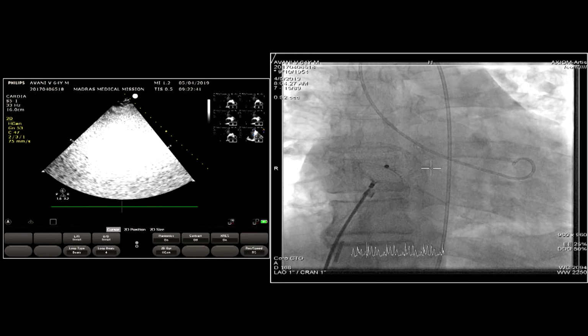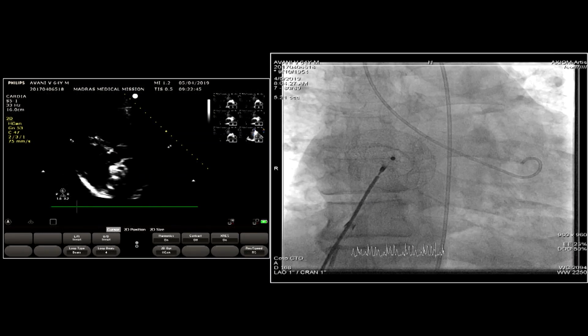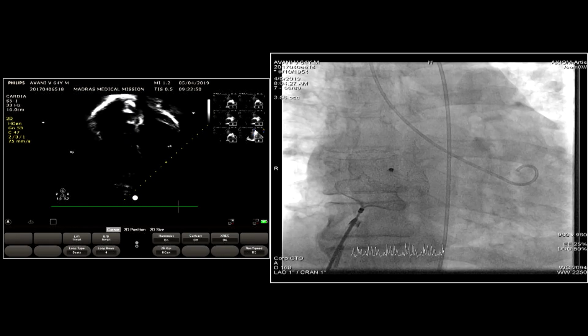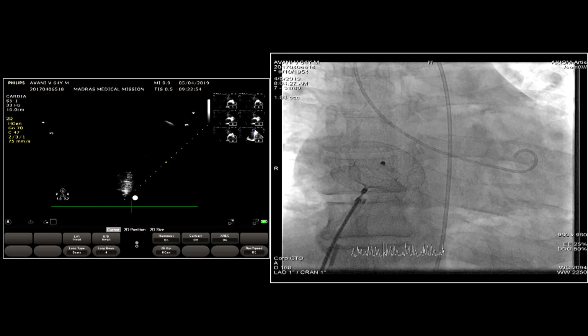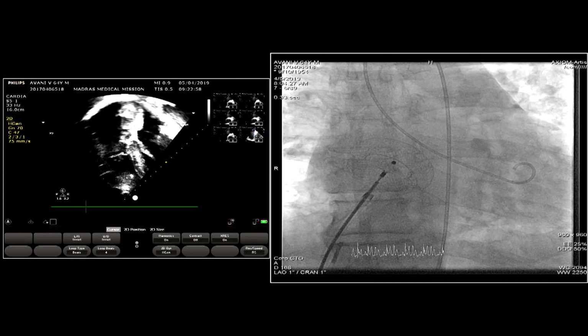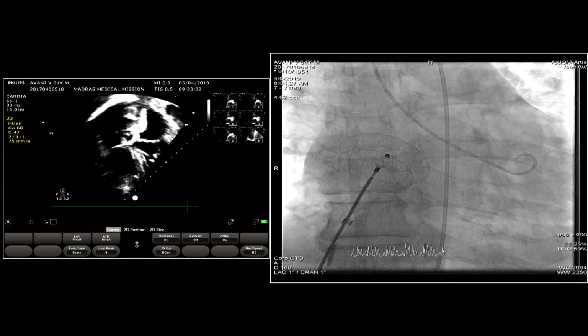Looks very stable. Yeah. So 40 milligram furosemide given? Okay. Give also a touch of fentanyl to him. He's probably anxious. A tiny dose of fentanyl. So now we are showing a thoracic echocardiography, even though it is marginally suboptimal. Still Srija is managing good quality images.